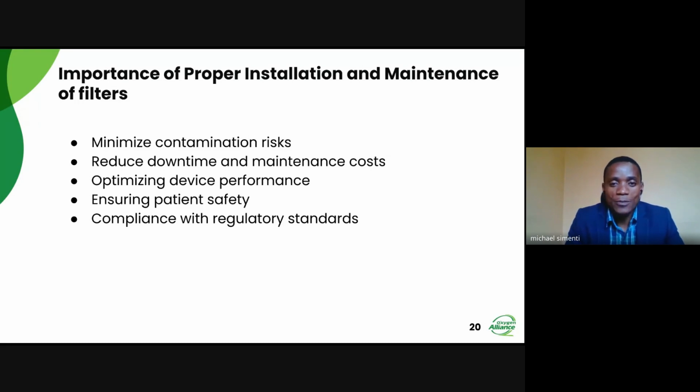Let's say the gross particle filter is not properly installed. Maybe you have left some gaps which allow some gross particles to get into the compressor. Definitely those particles will affect the compressor. The compressor may break down. And the moment the compressor is down, it means the whole system is down. So if it's a PSA plant, it will not function. If it's an oxygen concentrator, it can't function, because for oxygen generation to take place, we need that compressor.